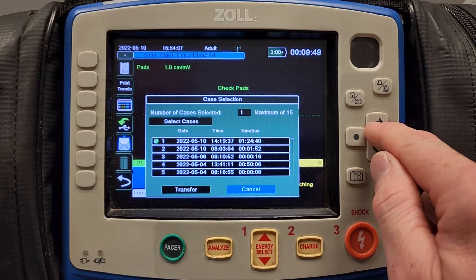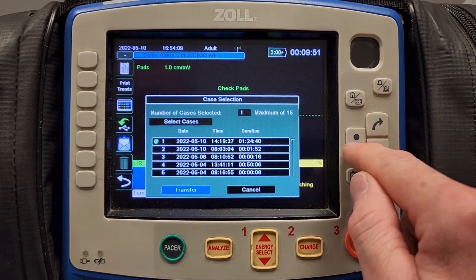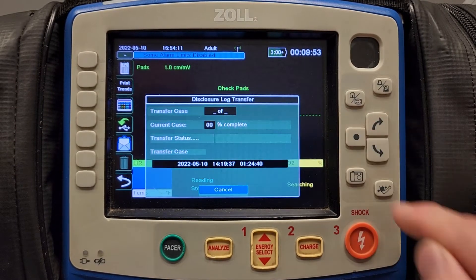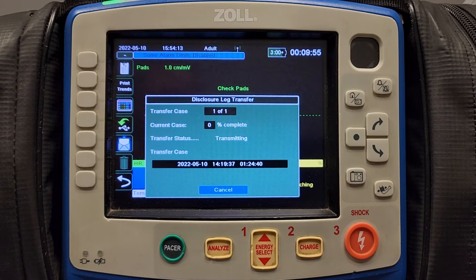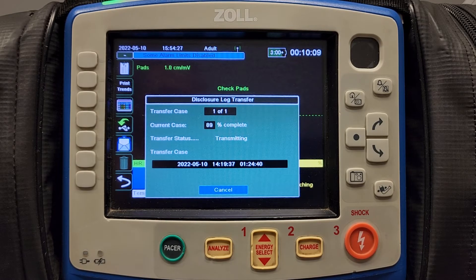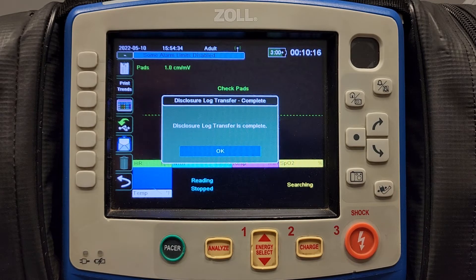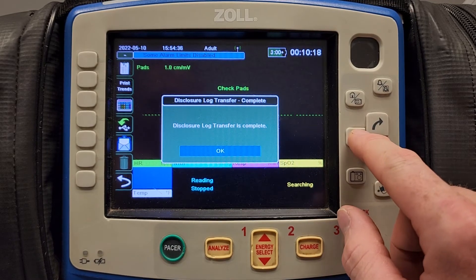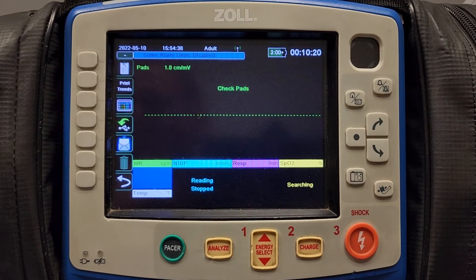Once you hit home, it'll allow you to hit transfer or cancel. I'm going to hit transfer now. This percentage will increase as the transmission is complete. The more data is being sent, the slower it takes to transmit. Once the transmission has been complete, your vital signs are available on the Zoll Cloud.